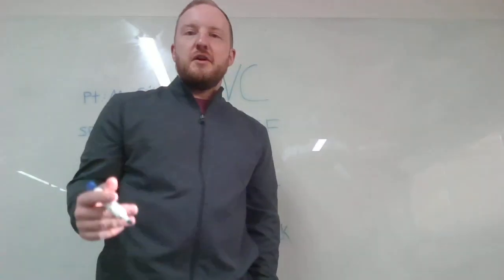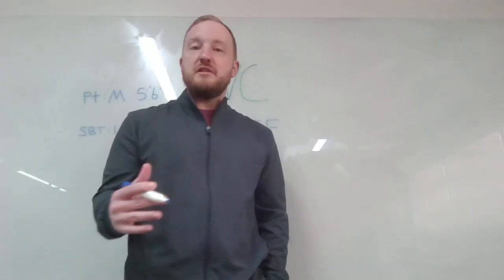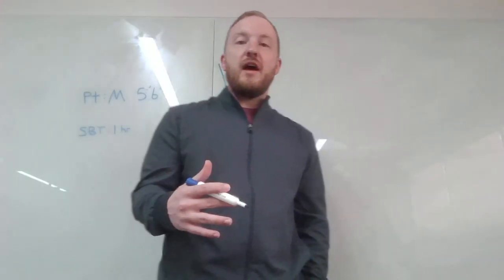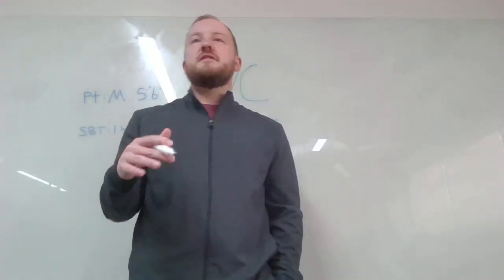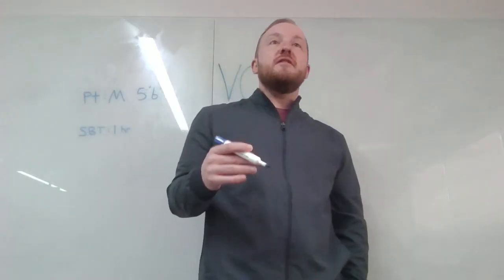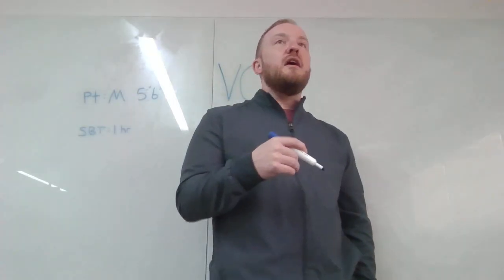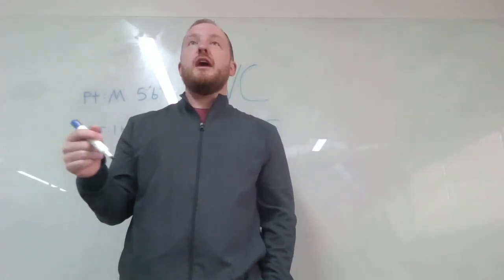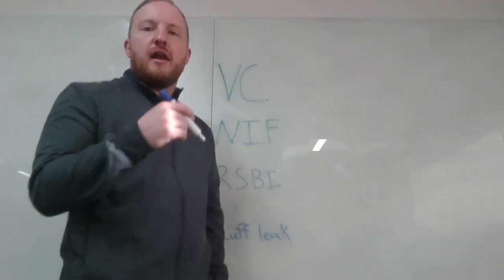So the topic that I chose to go over today is going to be weaning mechanics for a patient who's been on a ventilator that's going through a spontaneous breathing trial. You're going to come across a scenario that's going to be given to you where you're going to have to make the determination whether or not this patient can be liberated or extubated from the vent, right? So there's different tests here that we'll go over in a second on how we can evaluate.